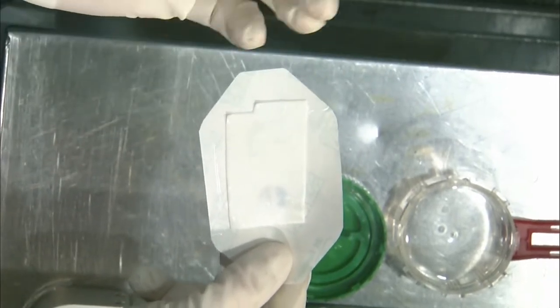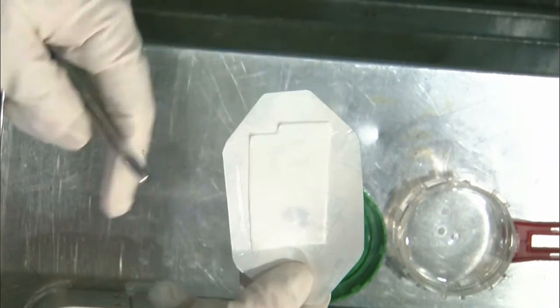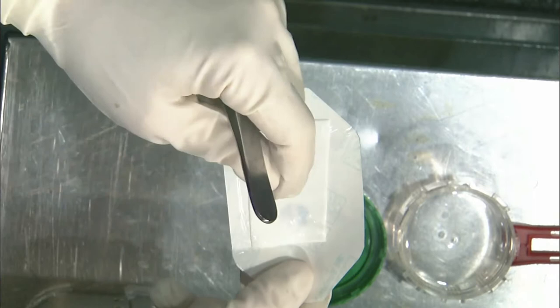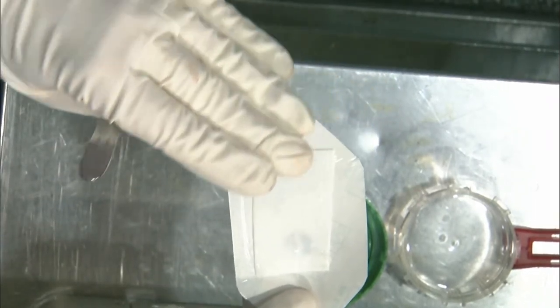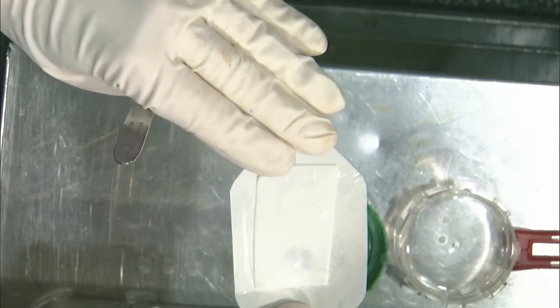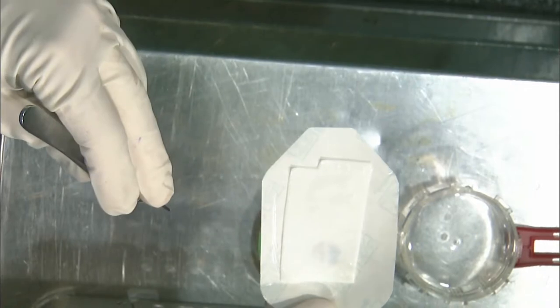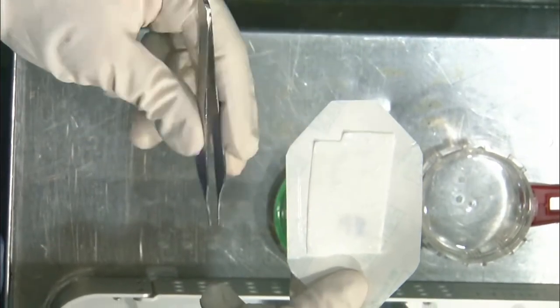The cell side facing up is much more of a rough layer with the cells adherent to it, again in a homogeneous population around that. This side down is much more of a smooth layer. So it really creates a barrier between the cells, the subchondral bone, and then the rest of the joint fluid and the joint surface itself. So there is a big difference between the two of them. It certainly cannot be flipped.